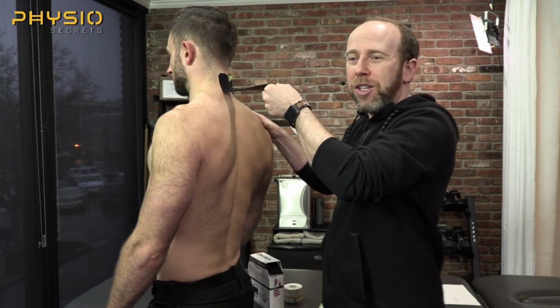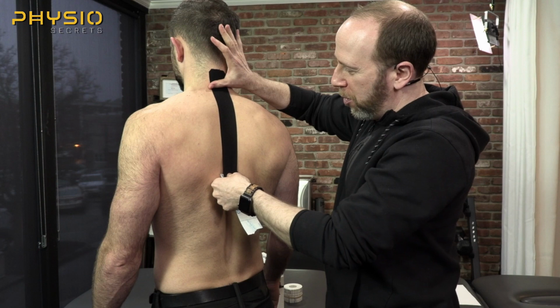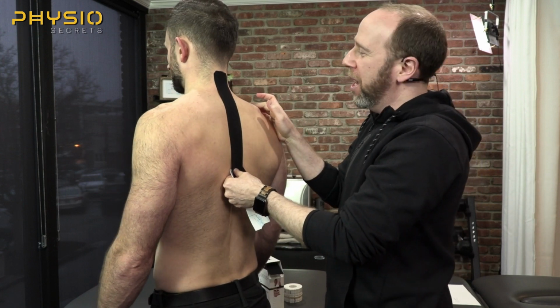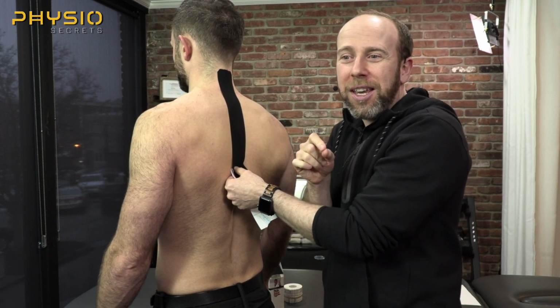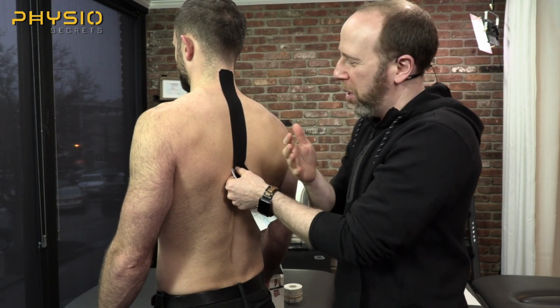That's interesting. Watch. You can actually see this. When I apply the tape, look, see how the pull is directional? Watch what happens when I let go. Can you guys see that? It's actually pulling from the top down and the bottom up. So it's doing the same thing the rubber band thing did. So if I apply a lot of tape stretch, lay this tape on and put it down, he's going to feel the tape stretching, but it's going to stretch constantly, so he's not going to know not to bring his head down because it always feels like the tape is pulling.